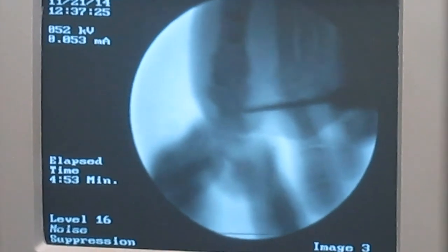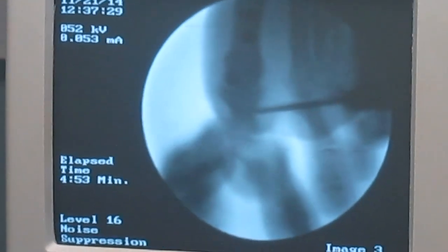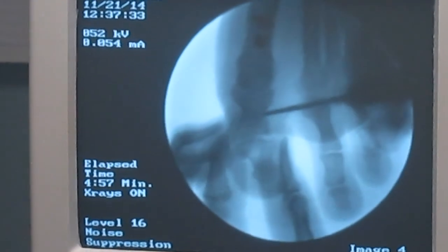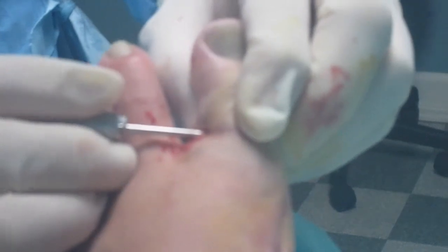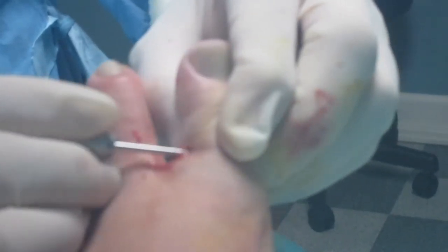I do have my burr on now. I don't run the burr real fast. I think a real slow movement is probably the best way to do the burr. So I make sure I've got the exact angle I want to be in. At this point we're working our way through the osteotomy. It takes a few minutes, and you can see it's almost through. So we're going to be keeping the medial dorsal part intact.